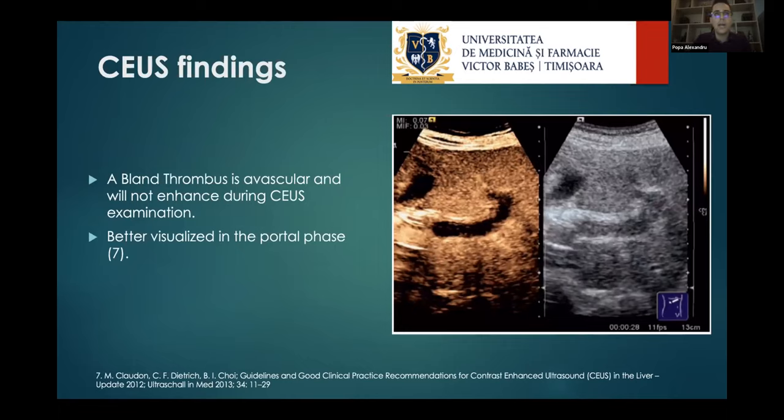When we have a bland thrombus, a benign one, this thrombus is avascular. It has no vascularization, so it will not enhance during CEUS examination, as we can see here. This aspect is best visualized in the portal phase.